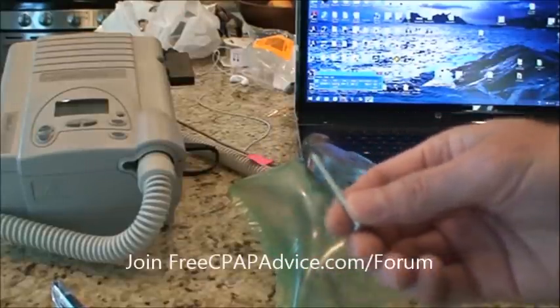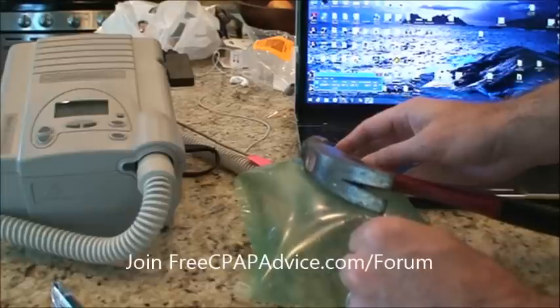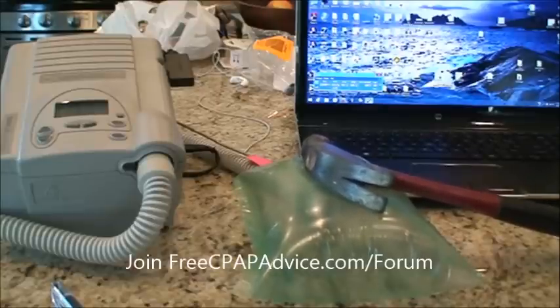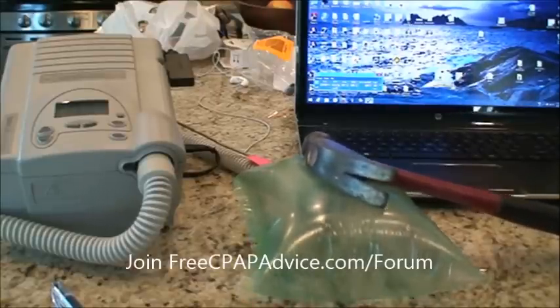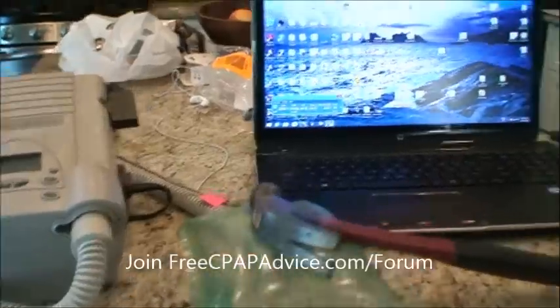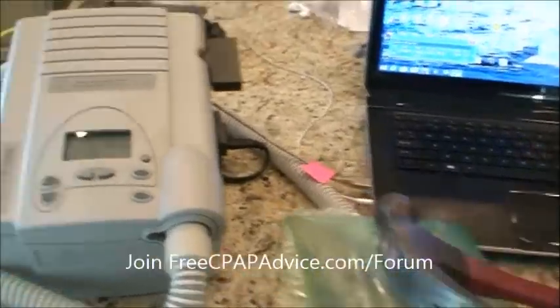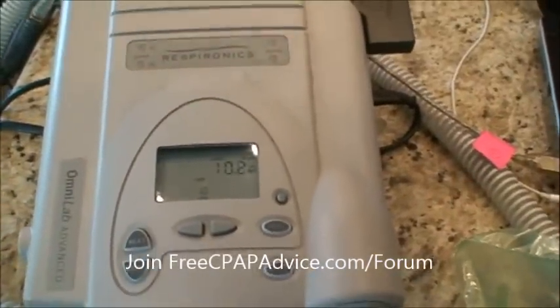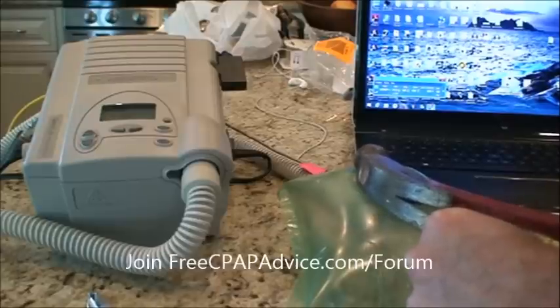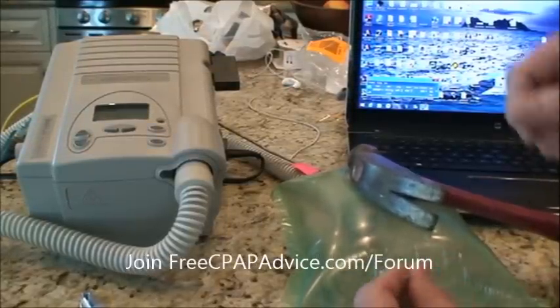So I'm gonna take our good friend, Mr. Nail, and I'm gonna puncture a couple holes in here so you can see kind of what happens. And okay, wait, our leak just jumped up to 28, 29, 30. So now with a little bit of a leak, we'd probably call this maybe a 5 liters per minute excessive leak, but you can see that our pressure being delivered is still okay. So let's go ahead and add a little bit more of a leak. Doesn't matter whether this is a mouth leak or mask leak, it's still a leak. It's still not great.